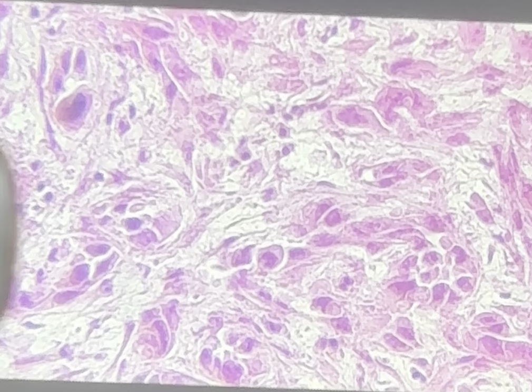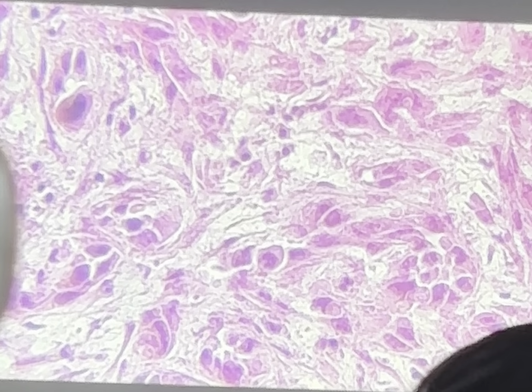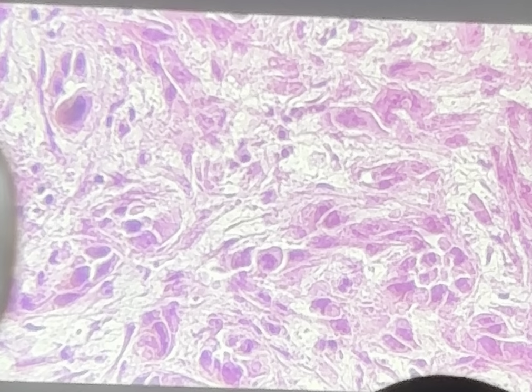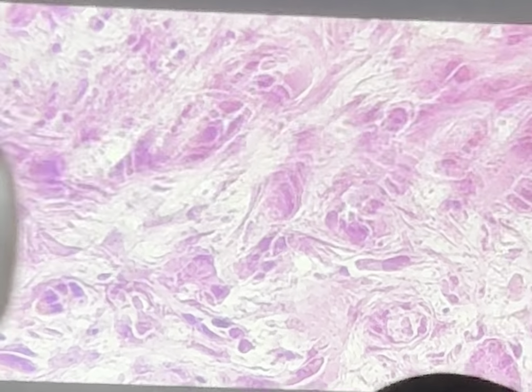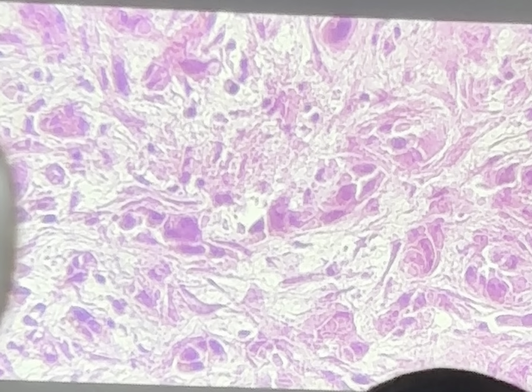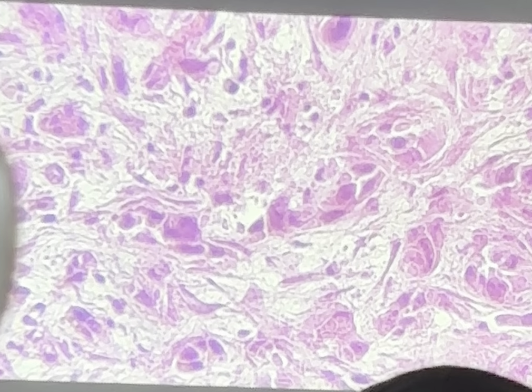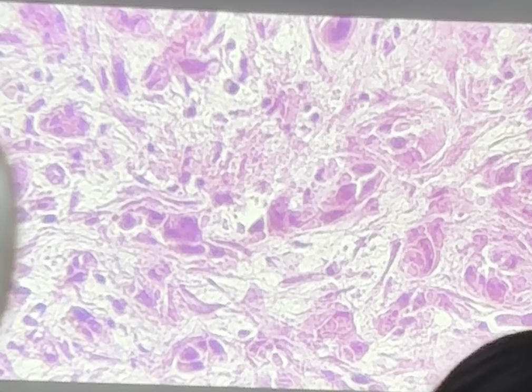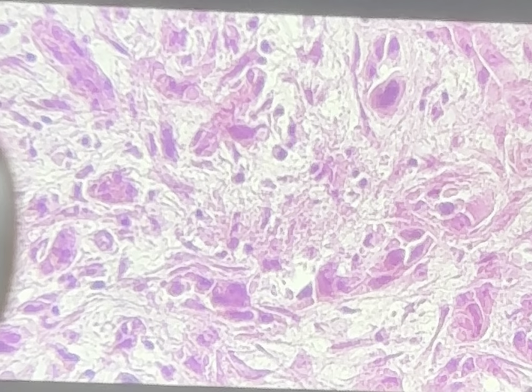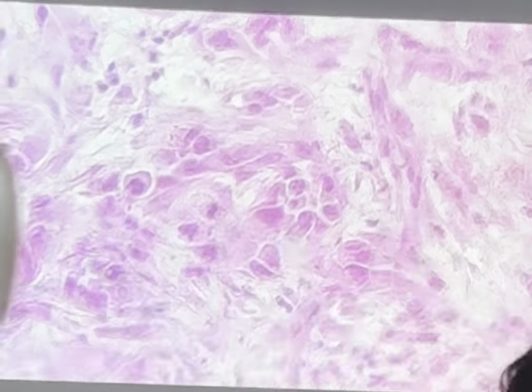They're called cholangiocytes. So this is a tumor of those cholangiocytes. So this is a cholangiocarcinoma, a tumor of the bile duct cells. Take a look, I just want you to look at the nucleus. You see the pleomorphism. You see the hyperchromatia. It's very invasive. It's not just forming a distinct mass, it's invading everywhere. And the background is somewhat collagenized and edematous with some inflammation.